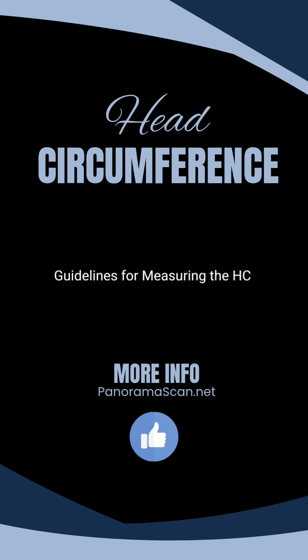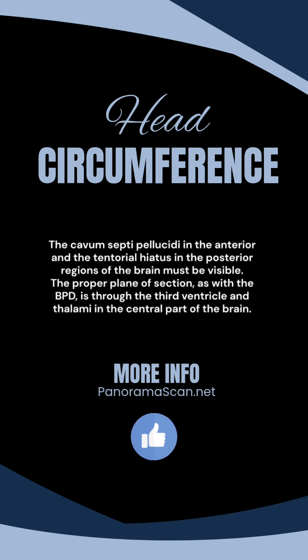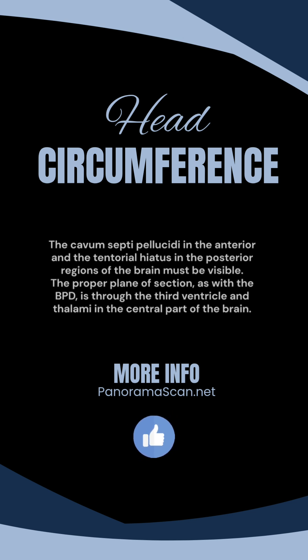The following guidelines apply for measuring the HC. The cavum septi pellucidae in the anterior and the tentorial hiatus in the posterior regions of the brain must be visible. The proper plane of section, as with the BPD, is through the third ventricle and thalami in the central part of the brain.